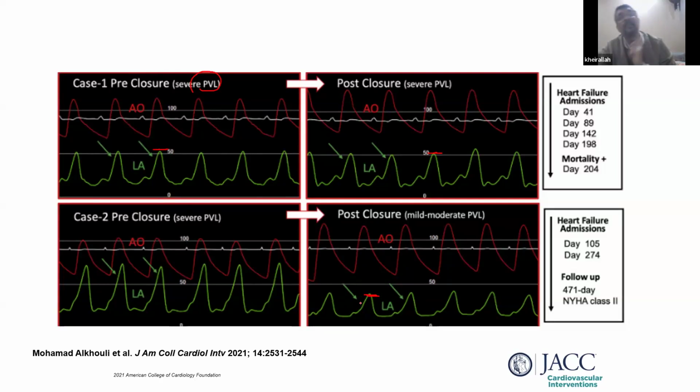And of course if you are doing simultaneous echo guidance, you would appreciate a significant reduction. So during the procedure you can check by echo, you can check by invasive hemodynamics, and you can check by both. Okay.